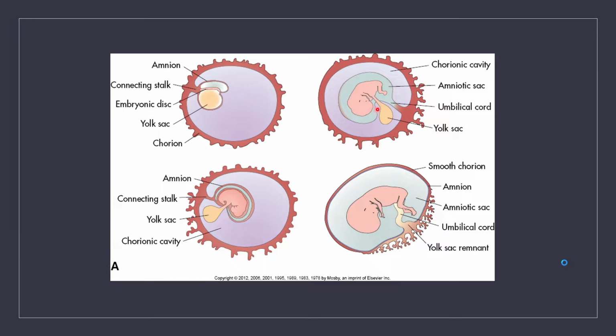And then we just continue to grow here to there to there to there, and that yolk sac goes away by 12 weeks. So if you see an embryo or you see the fetus in there and there's no yolk sac, before you even do measurements, you can say, okay, there's no yolk sac. We know they're at least 12 weeks along.